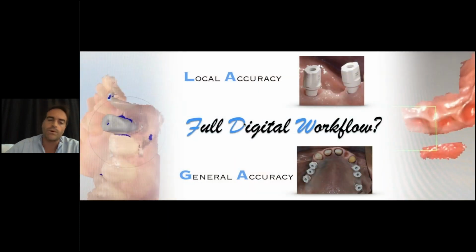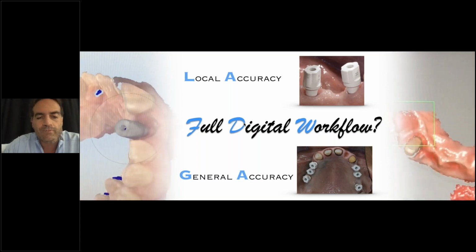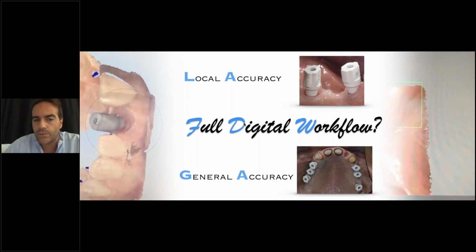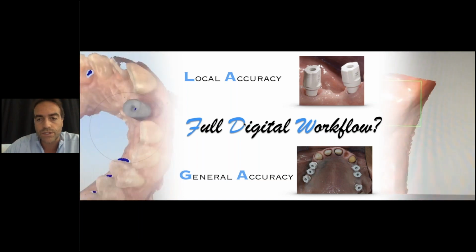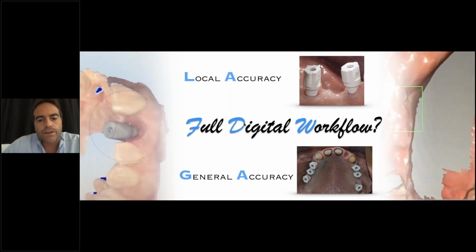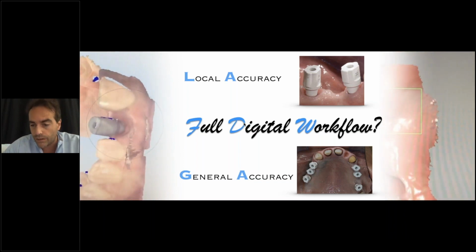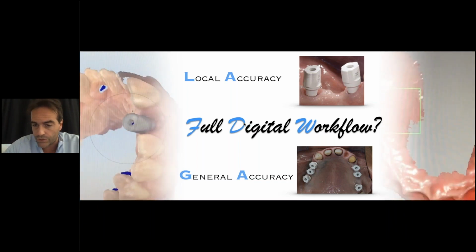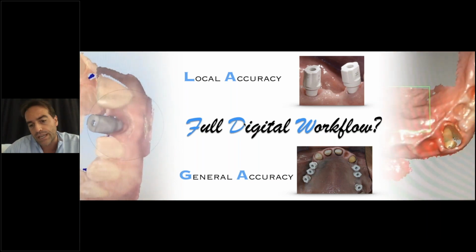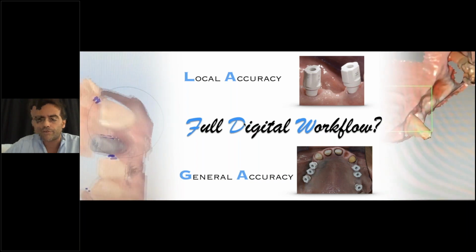And so, entering more into the topic of today, we were mentioning: can we be predictably fully digital all the time? Or maybe it's different when we are talking about local accuracy, so single implant or short span implant bridges, or maybe when we are discussing full arches, full arch on implant rehabilitation, or partial edentulism with implants, like the image that you have here on this slide. Should we make some further consideration?